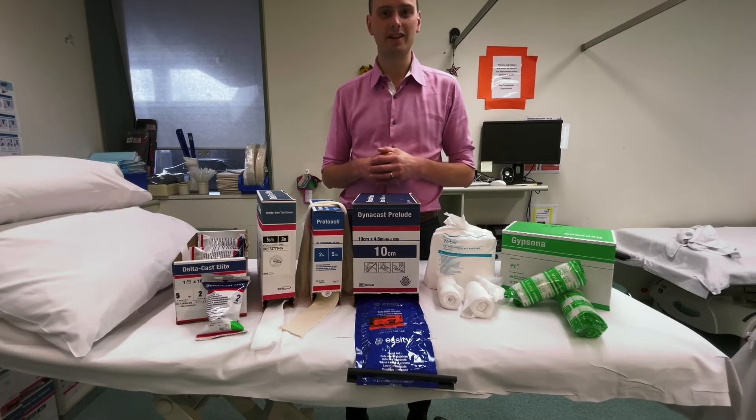Plaster of Paris is a bit more messy in terms of white material getting on the floors, but it is probably more commonly used in most departments.